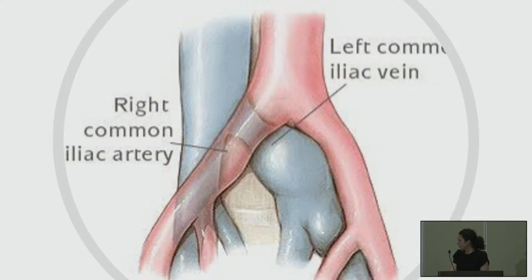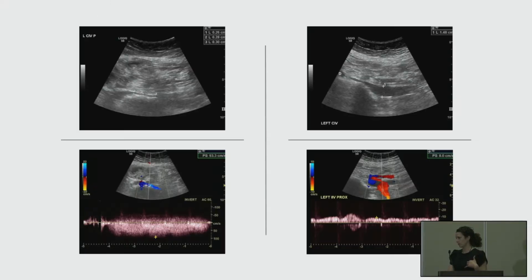The second more common area to have reflux is through the internal iliac vein, and that's going to be caused from a common iliac vein compression. We went through a lot of that during my previous talk, so I'm not going to go into a lot of depth with it, but mainly to know that if it's severely compressed, the flow is going to get to the point where it can't leave the common iliac vein anymore, and it's going to start retrograde feeding into the internal iliac.